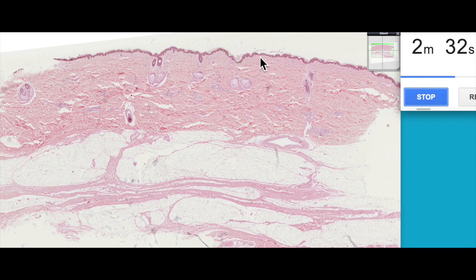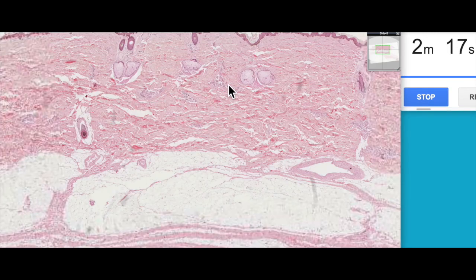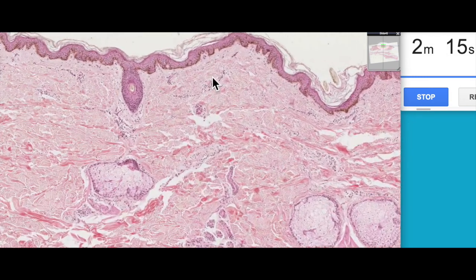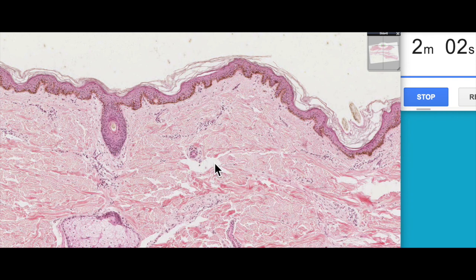Then we have two layers of connective tissue known as the dermis. The layer immediately beneath the epidermis here is known as the papillary dermis, because it forms these sort of projections. If we zoom in here, we can actually see these little upward projections of the connective tissue — the papillary dermis — and these are known as dermal papillae, which means little projections. This is made up of a layer of loose connective tissue.